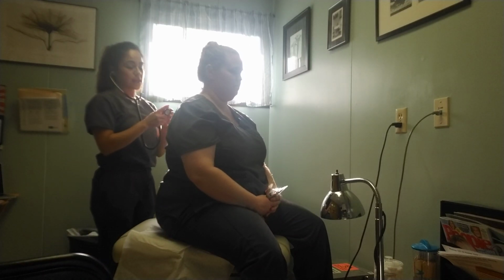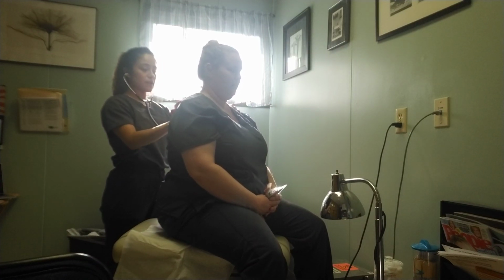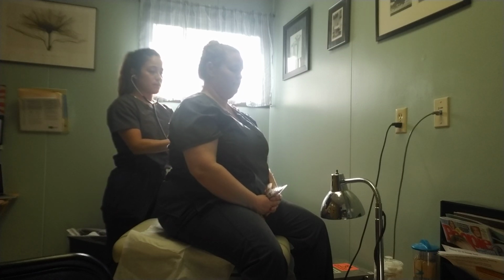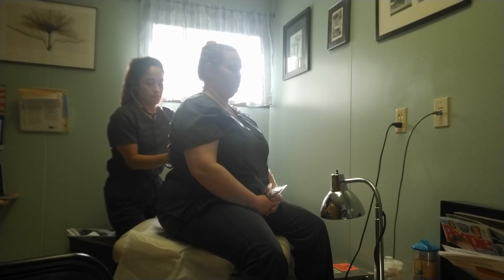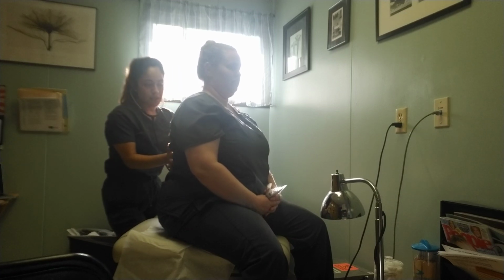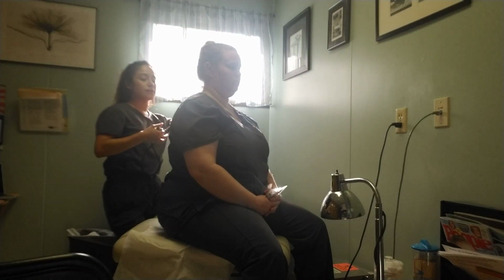Alrighty, and I'm going to auscultate her lungs. I'm going to have you take a deep breath. Perfect. Again. Perfect. And again. Perfect. And one more time. Actually, I lied. One more time. Beautiful. Her lungs are clear and equal on auscultation bilaterally.